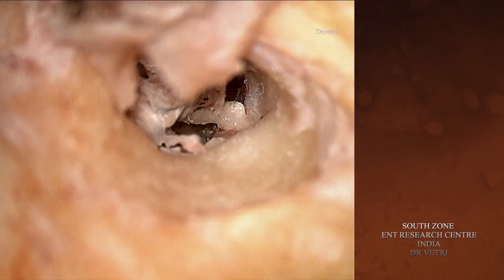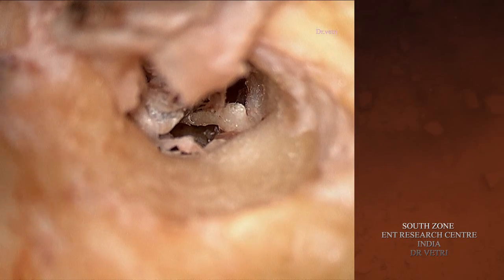I am using a scissor to cut the attachment of the tympanic membrane to the handle of malleus.